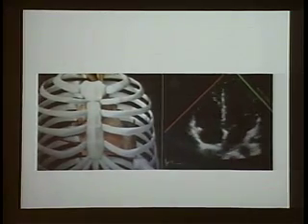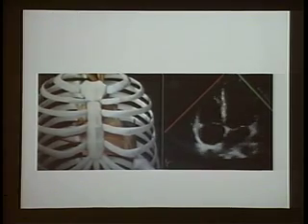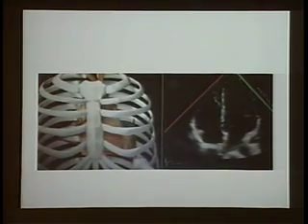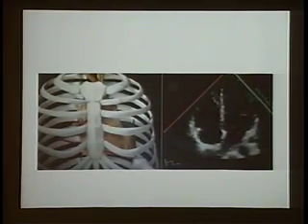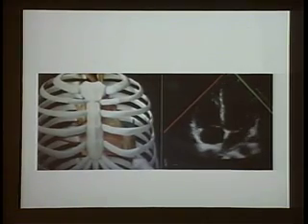One of the things that we do for this view that helps you get a better image would be to turn the patient towards the left side. You'll see this in the echo labs. They always ask the patient to tilt towards the left side, and that helps you, brings their heart closer to the chest wall. You can ask the patient to exhale and hold it like that without air. That also helps. When you take a deep breath, the image kind of gets very blurry. When they exhale, it gets better. So again, you can use positioning and breathing to assist you in getting a better image.